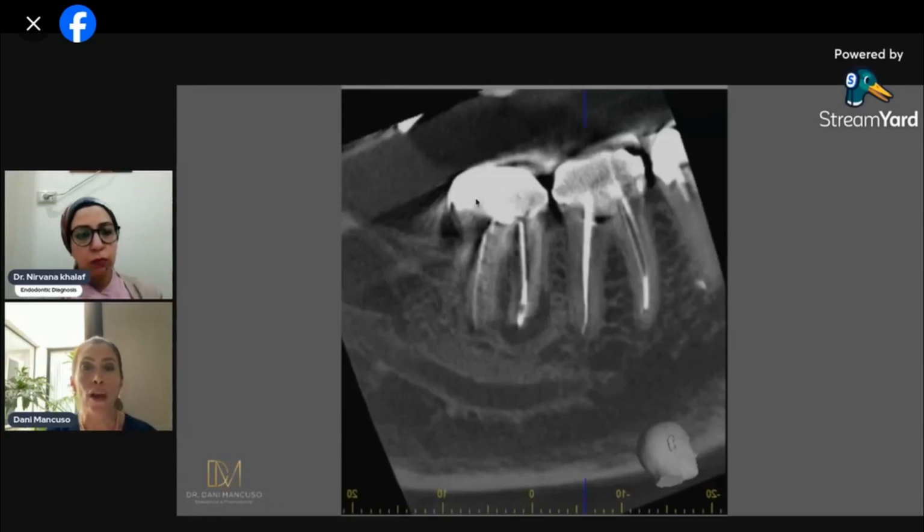So you know now that the second molar is probably the culprit of the pain, because all the others seem fine, but there is quite a large radiolucency apically on that tooth. So then it's a lot easier to communicate with your patient as well and explain that this tooth is the most obvious one, and we are going to start the retreatment with that one and monitor the pain to see if the pain will subside.